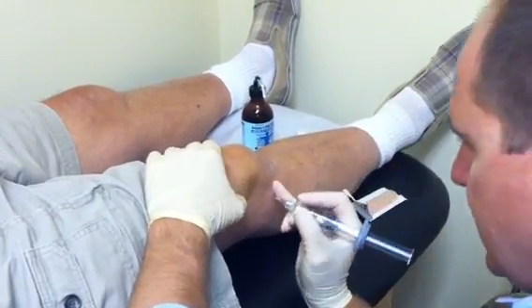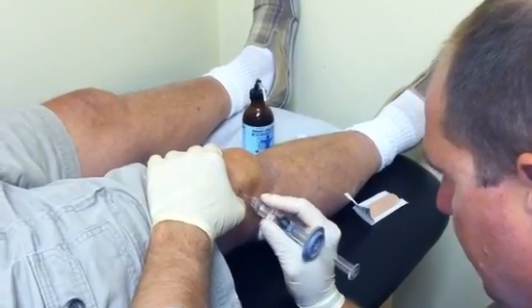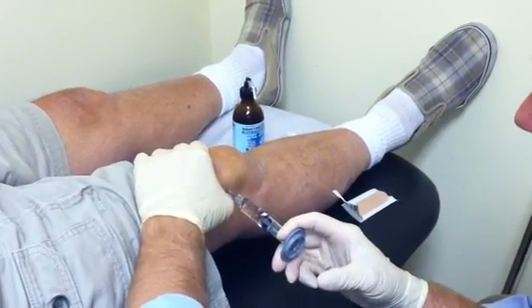This is a thick fluid so it takes a while to go in — big stick, sir. A steroid shot can go in real fast, so these go in a little bit slower.